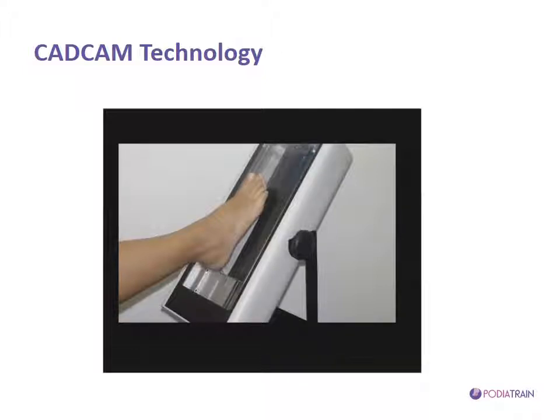Moving the laser beam across the plantar aspect of the foot will provide us with a lot of points, and thus we create what is known as a point cloud. And this point cloud, which will normally consist of thousands or millions of points, when joined together will produce the plantar aspect of the foot.